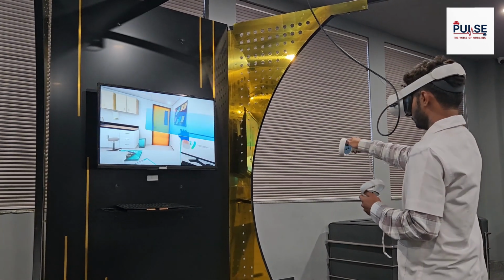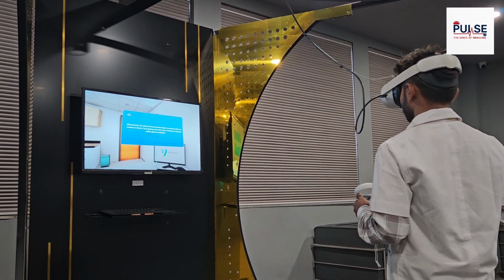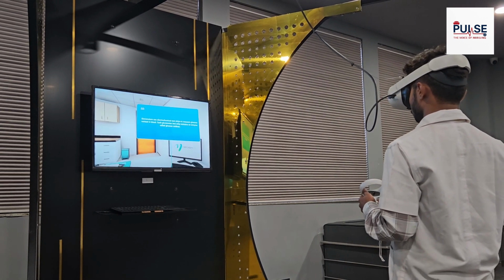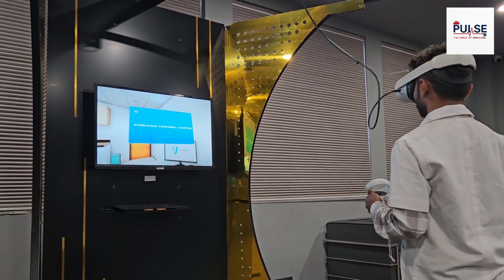Glucometers use electrochemical test strips to measure glucose content in blood. Each glucometer test strip contains an enzyme called glucose oxidase. Glucose in the blood plus glucose oxidase gives gluconic acid.